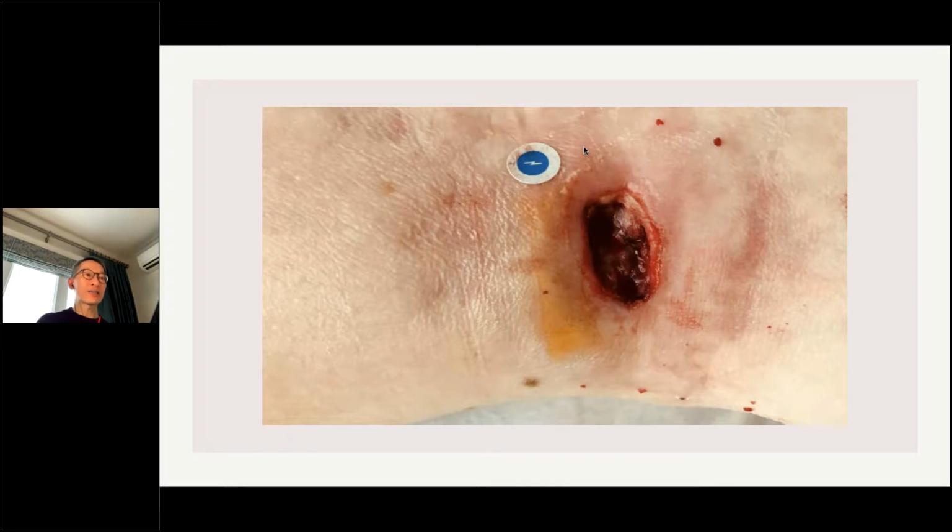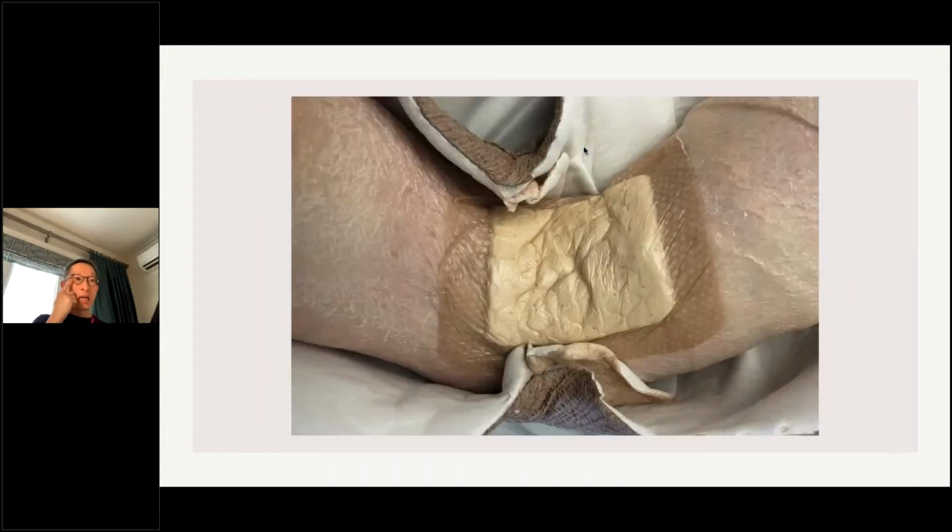And this is a case, again, from the hospital. What you're looking at is right around the front of the ankle area. This is a pressure injury, believe it or not, induced by compression bandages. When the compression is cutting too tight, especially depending on the location and how the person is positioned, the ankle area can develop a crease where there's a lot of pressure against the skin.